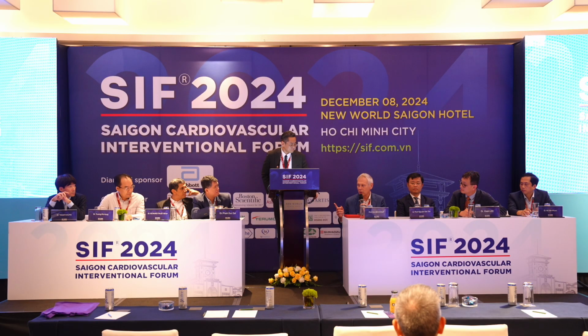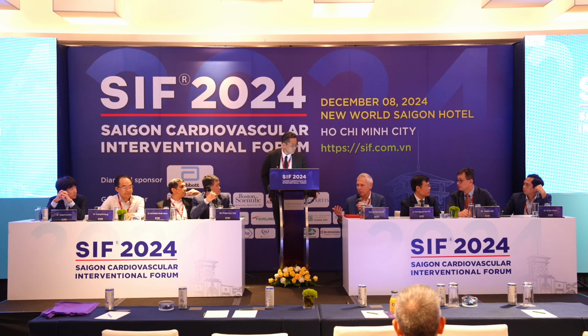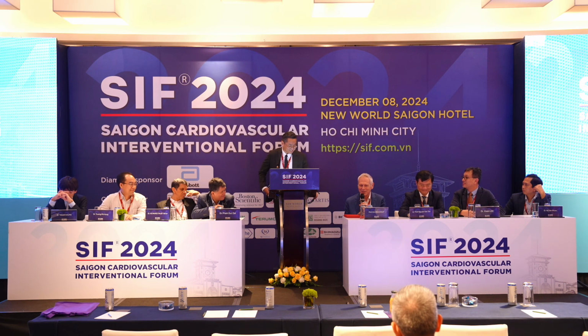One other complication that I have seen a few times is torsion. When you deploy the stent, some stents will have torsion, and when you try rota stent or treat them by lithotripsy, there will mostly be stent fracture that you have to treat with a second stent. But I've seen a few cases where there is really torsion on the stent. And of course, this was an Orsiro, which is not the most... It's a good stent for some indications, yeah.